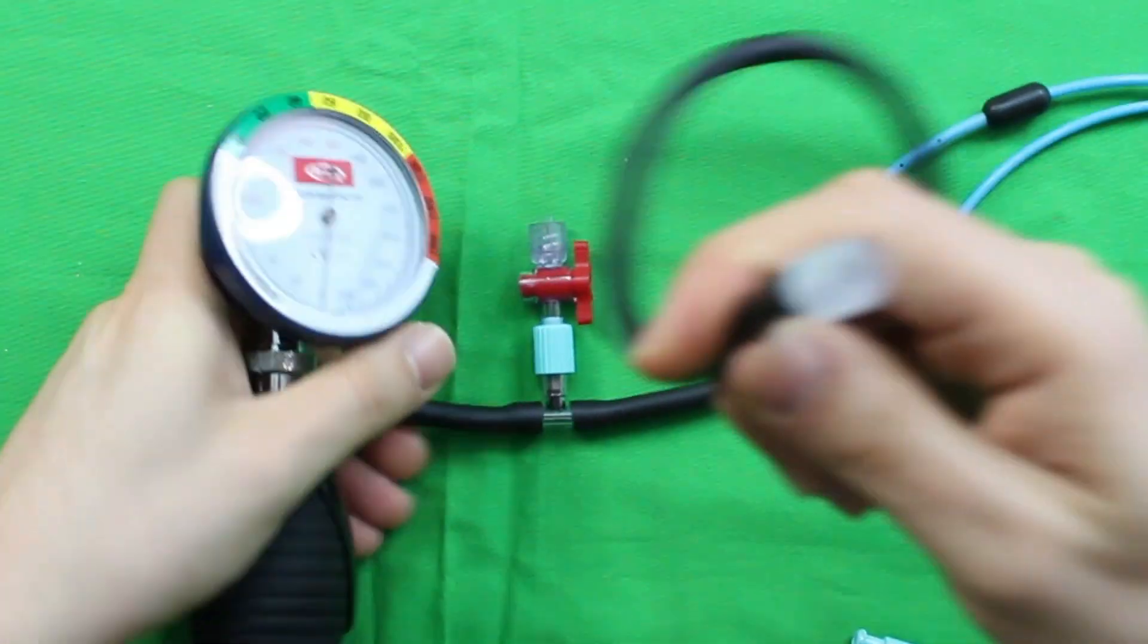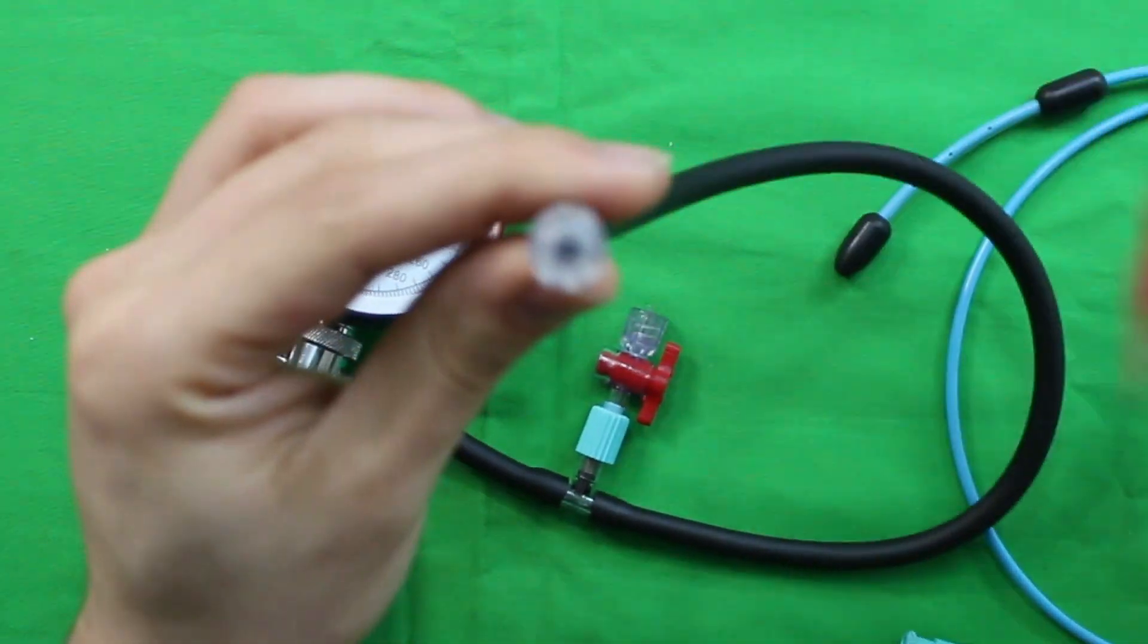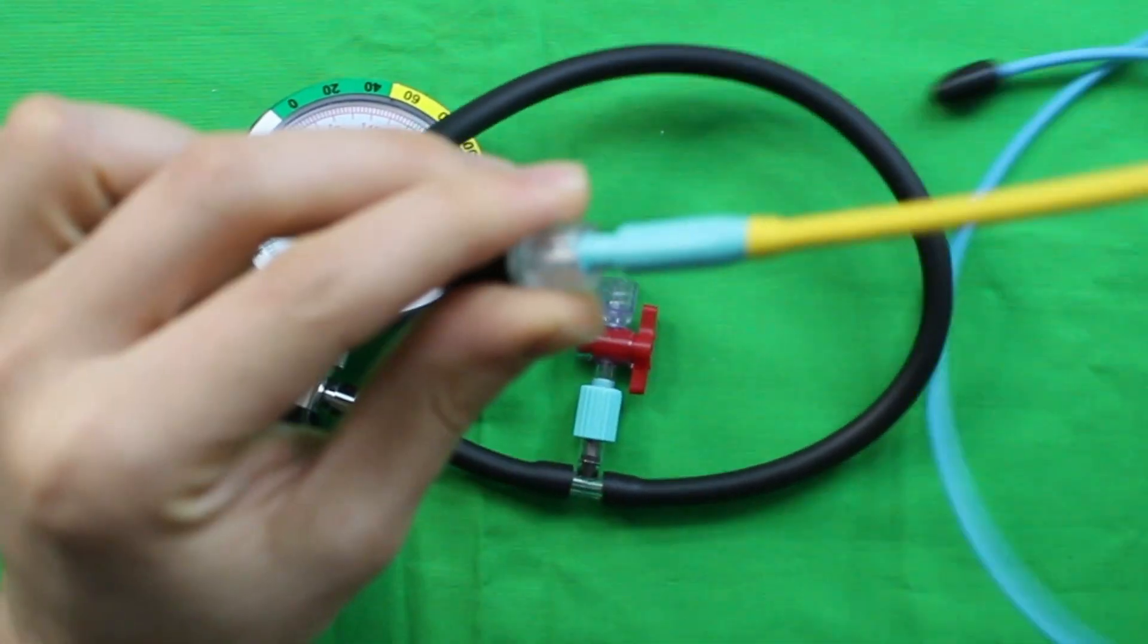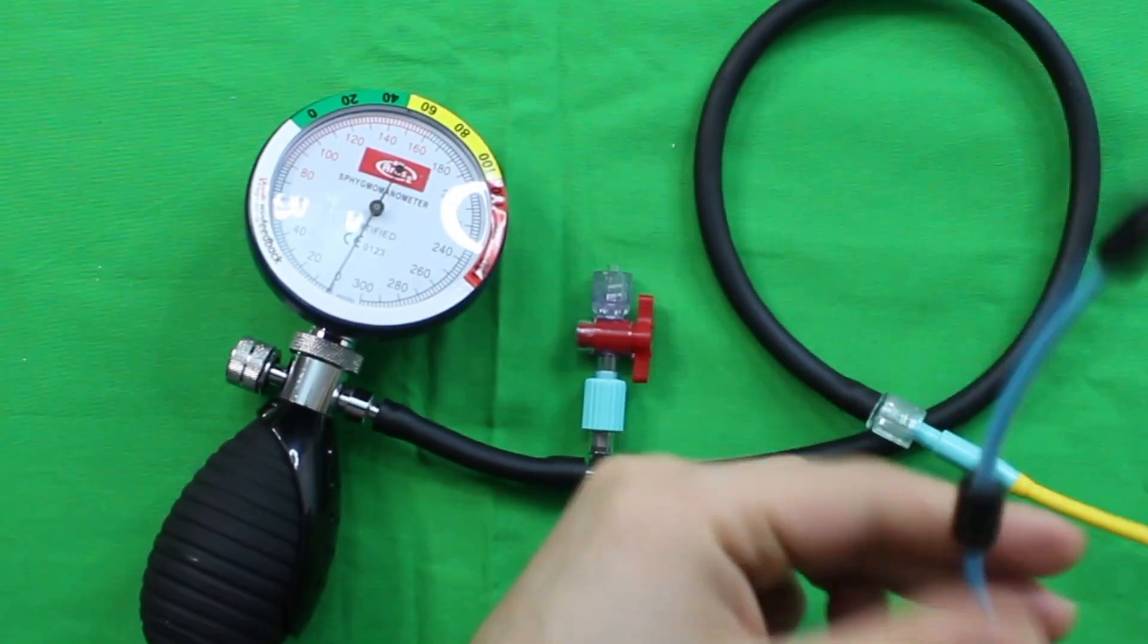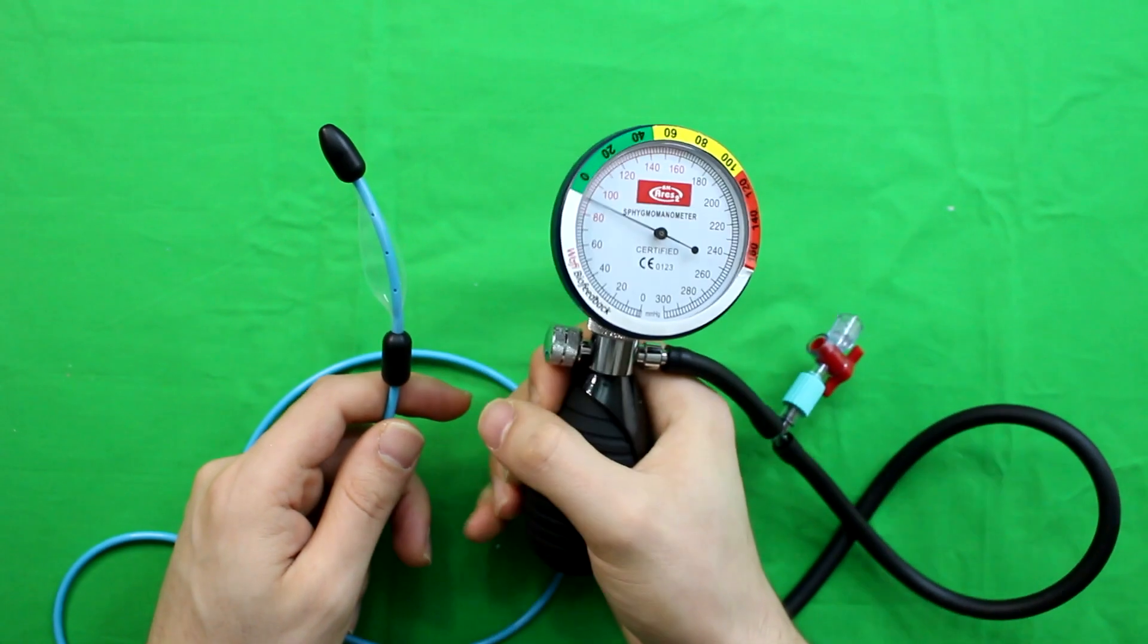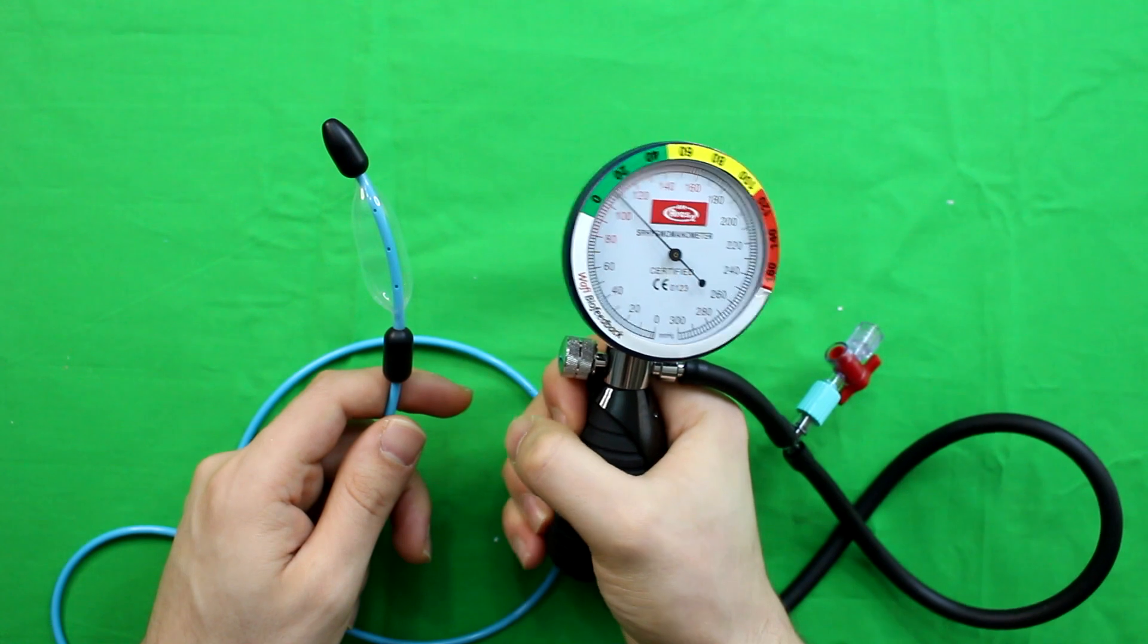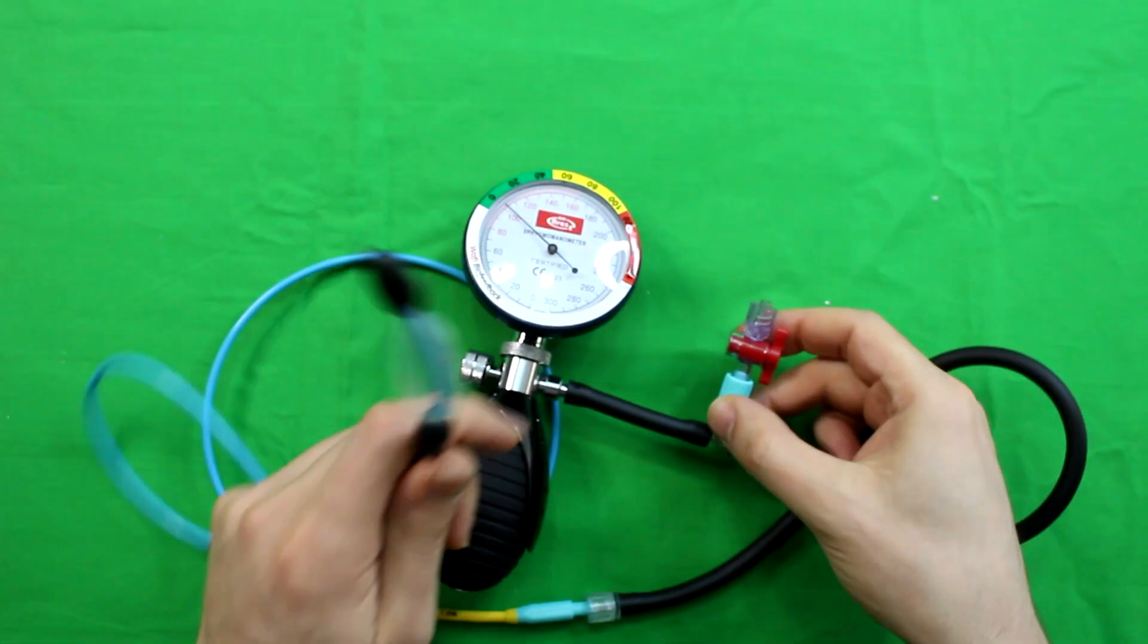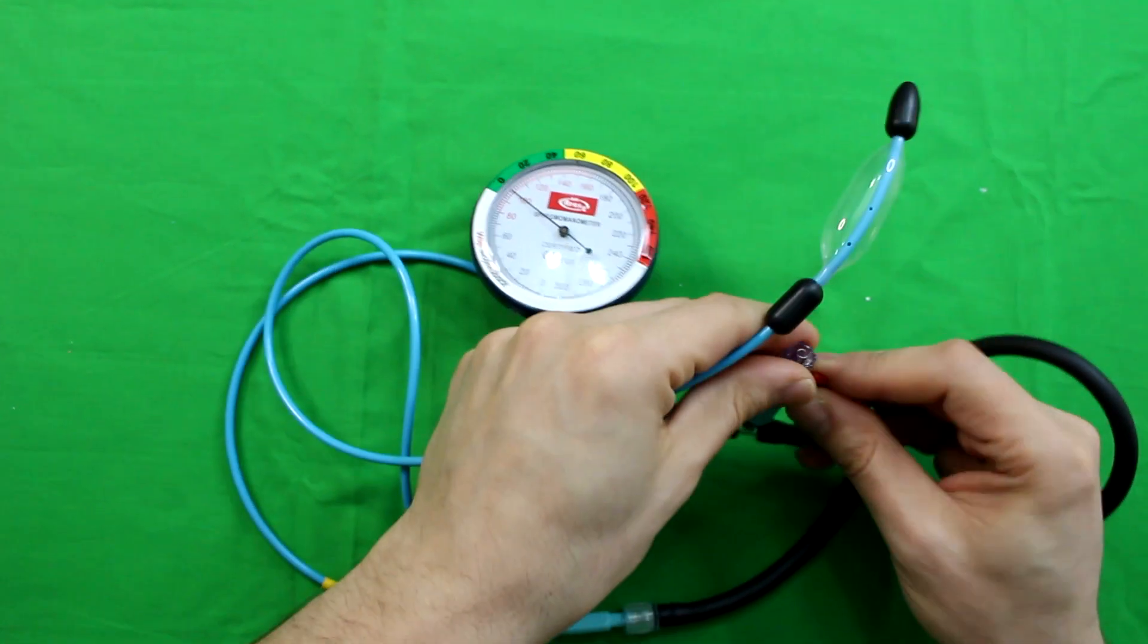Connect the catheter with the valve cable. Inflate the balloon gently while the valve is open. Close the valve after the balloon is inflated.